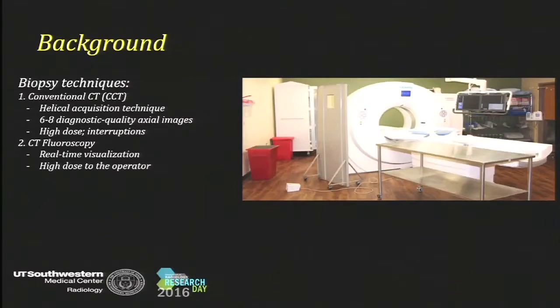The second technique is called CT fluoroscopy. You acquire real-time images. The operator stands here. They place this foot pedal adjacent to the scanner. Patient's still here. They press on this foot pedal, they hold it down, real-time images here, guide the needle, and get to the lesion. Now, the downside of that is that it is a high radiation dose to the operator, especially to their hands, and that has actually been shown in the literature.